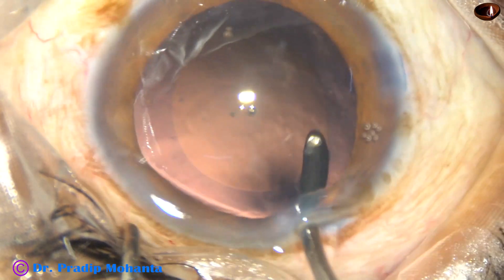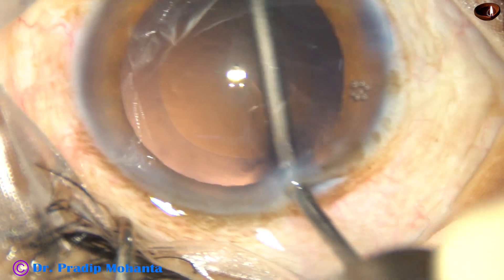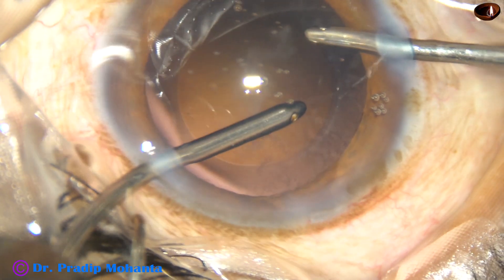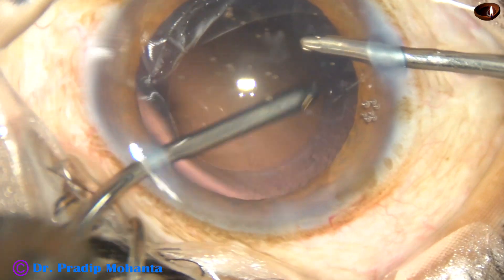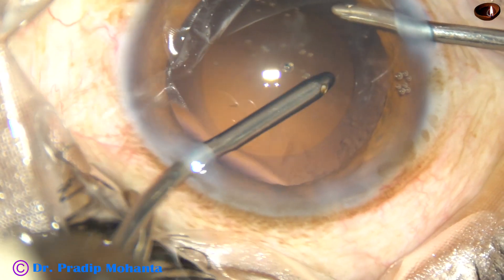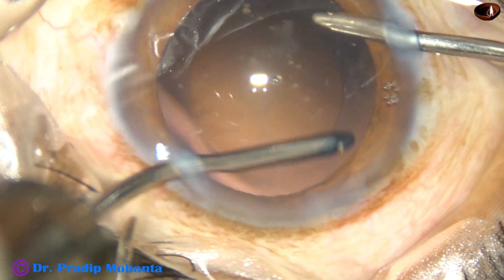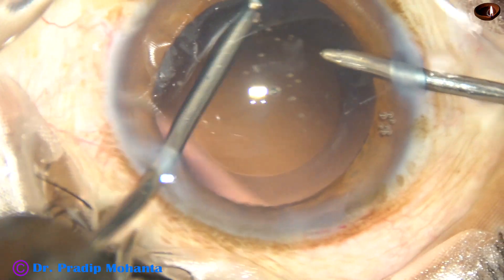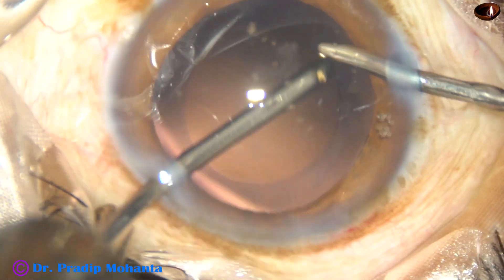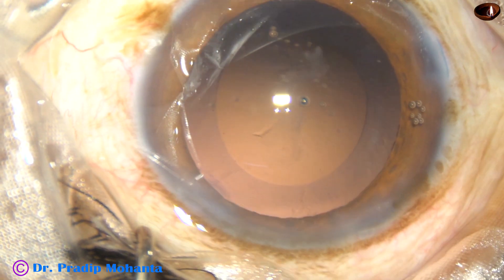Rest of the surgery is edited. Cortical clean-up is done very thoroughly with bimanual irrigation aspiration. At this time I am doing hydro polish. I have asked my assistant to go to capsule polish mode, and I am going to polish the capsule with low vacuum. It is nicely done — a thorough cleaning of cortical matter.